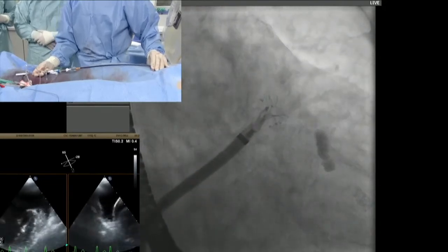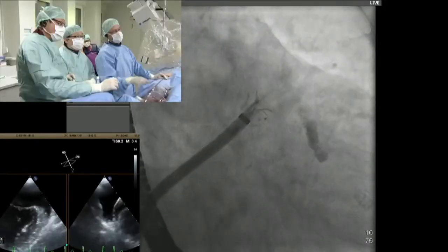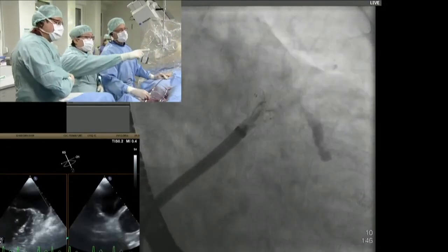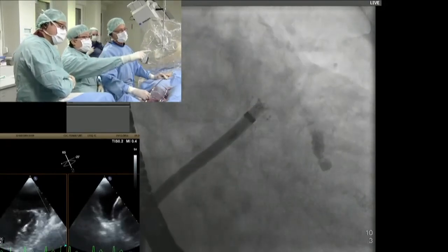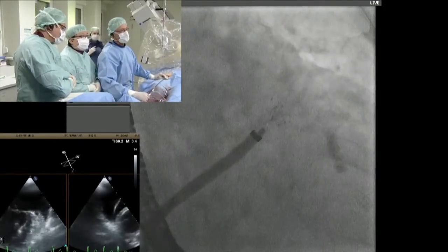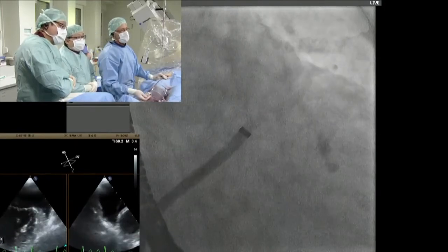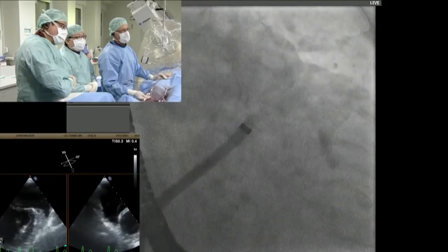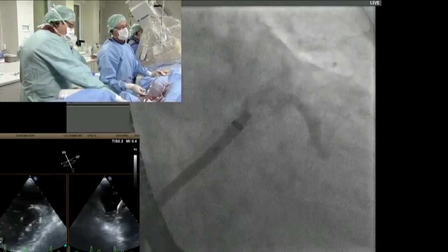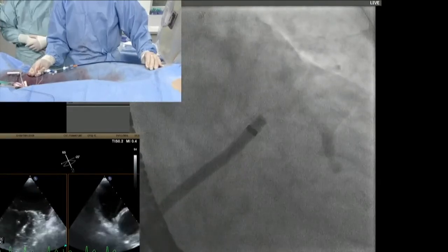I think the umbrella is not fully opened yet, although the struts are pointing backwards, right? You see, but not all of them. And there's a radio-opaque marker that separates the umbrella and the cover. So maybe we should pull back the whole system and then redeploy it more proximally. So I pull back and start about here. Let's give a little puff. A little bit more. I'm exposing a little bit.